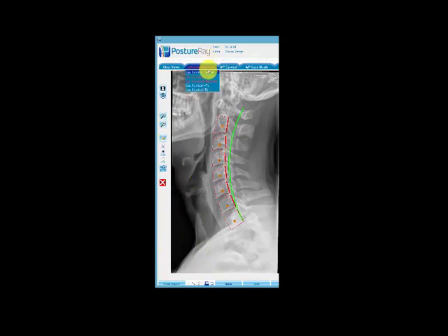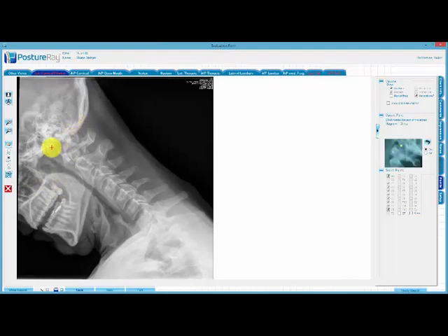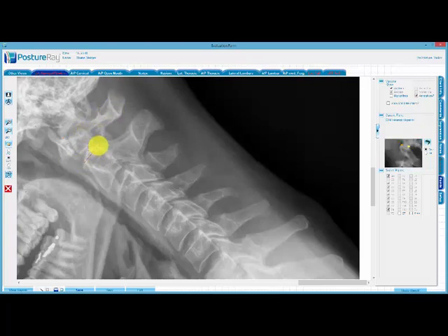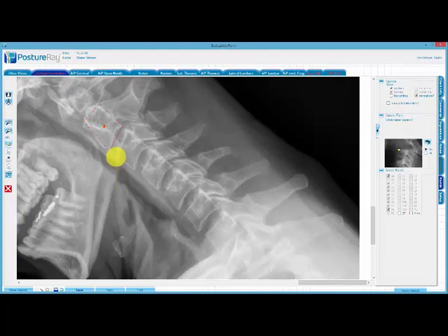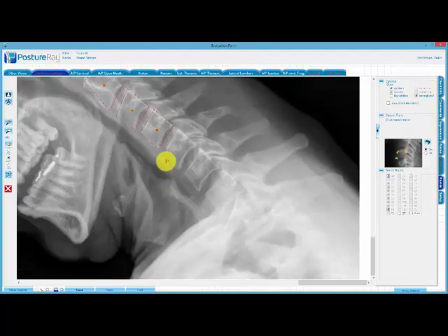With this image in front of you — this is a side view of my neck — I've already ruled it up, and I'm going to demonstrate how we do that. There are a number of points that are marked and we click through all of these points. It does take around about 20 minutes to do analysis on a full set of x-rays. I'm going through and marking each individual vertebra. On the lateral views we use four reference points, and on the AP views we use three reference points.